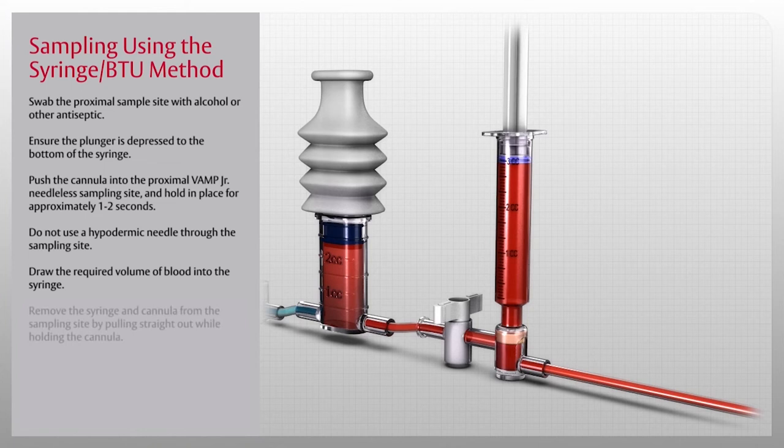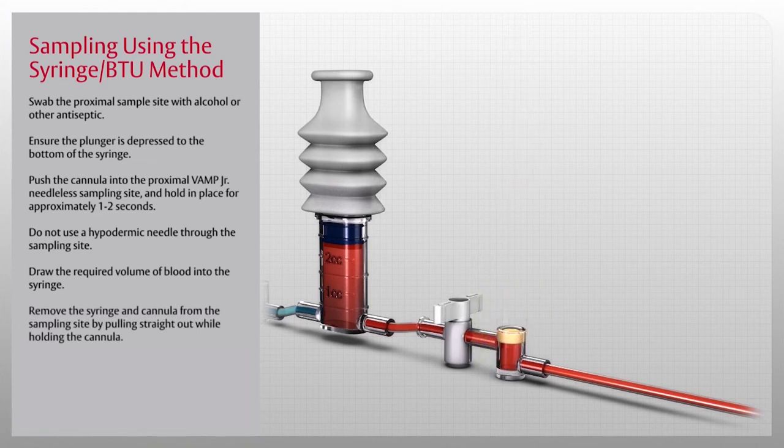Once the blood is drawn, remove the syringe and cannula from the sampling site by pulling straight out while holding the cannula.